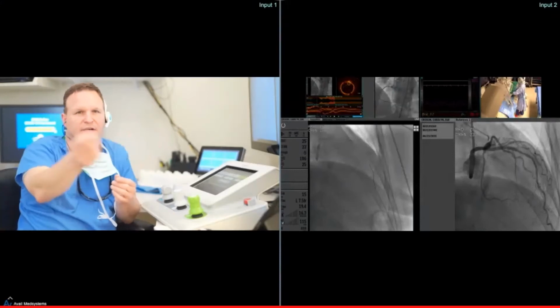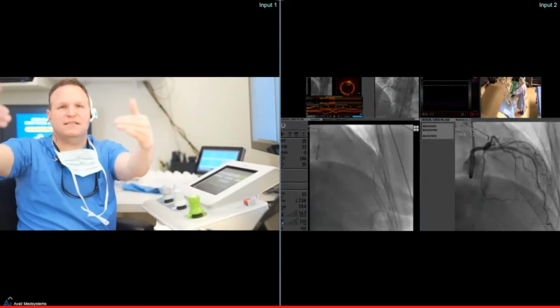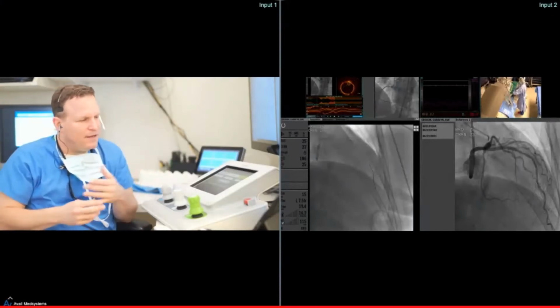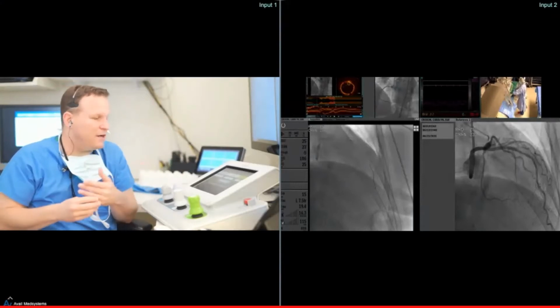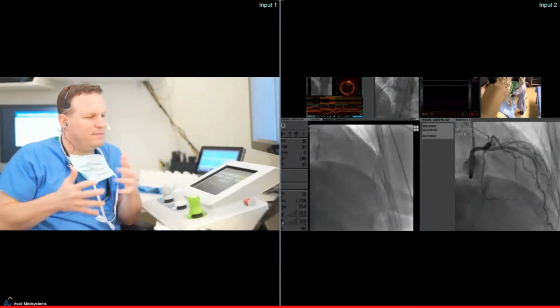Our team's very good at it. There's a kind of a brake on it where you can put the wire in and just brake it. Put the second system into the motorized control that will actually wire down. So you can do one at a time and toggle between the two. Our team is outstanding, and they've gotten very comfortable with this, but there's a learning curve there as well.